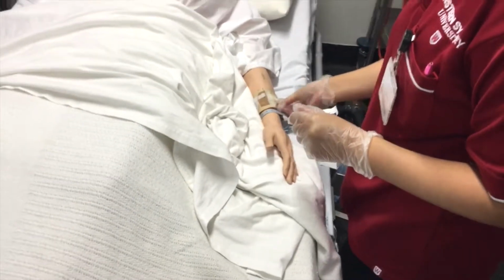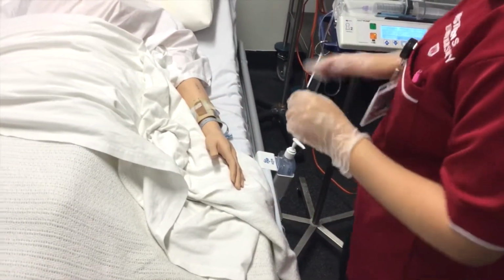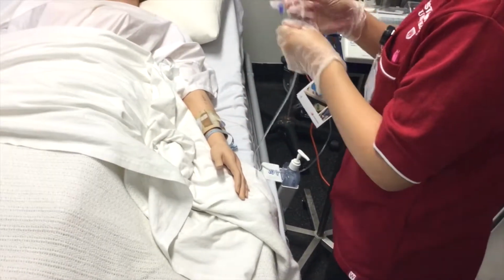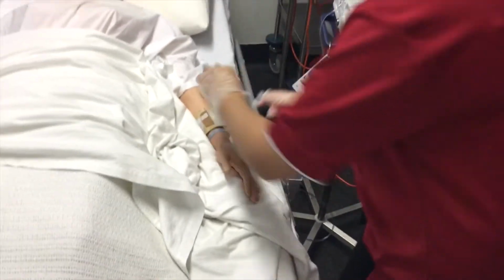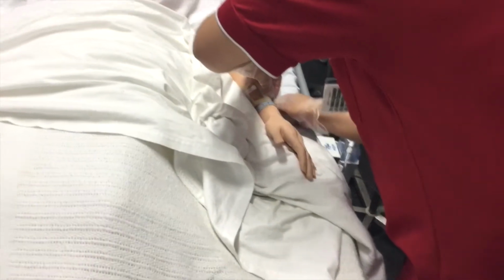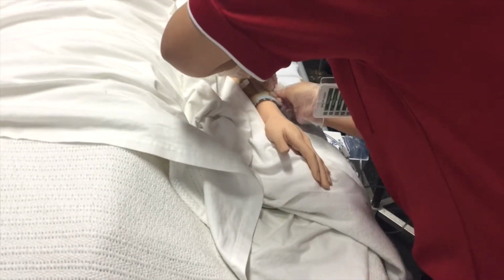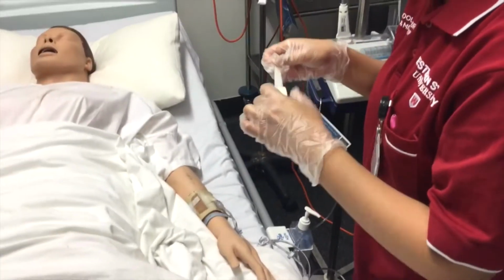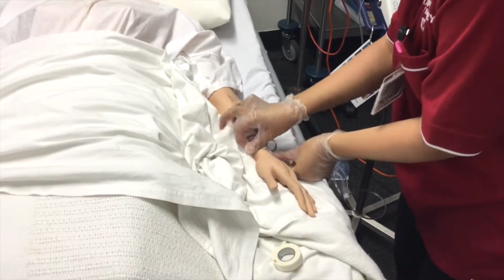And I'll leave this to dry for 15 seconds. And once it's dried, which is now, I'll connect the medication. And I'll put tape around the side as well so it doesn't fall off or cause you any discomfort.